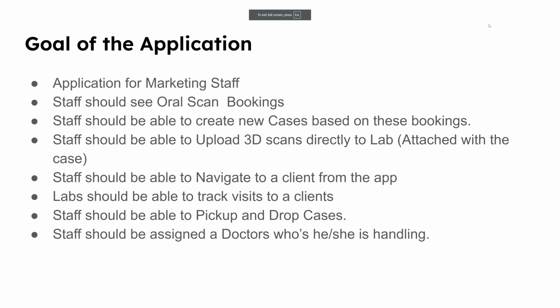Oh, sorry, not this slideshow. Okay, so Roadrunner is basically an application for your marketing staff. So that sums it up. What features will it have? The staff should be able to see oral scans. So the doctor should be able to book an oral scan from the application. We'll discuss that in detail.